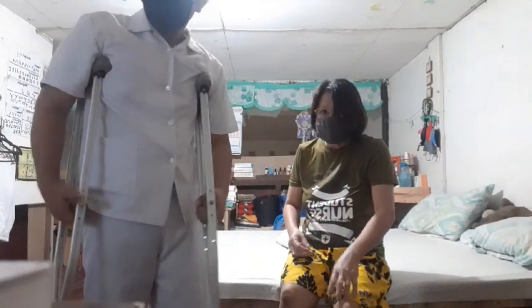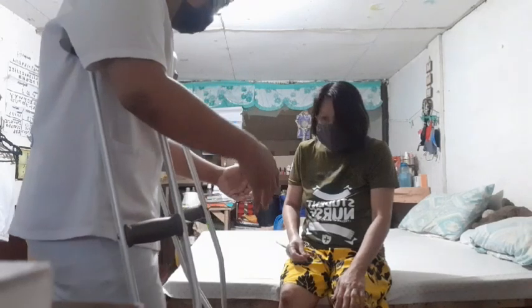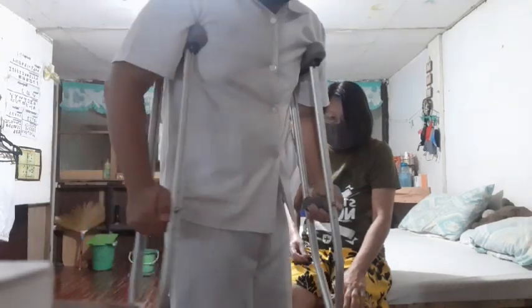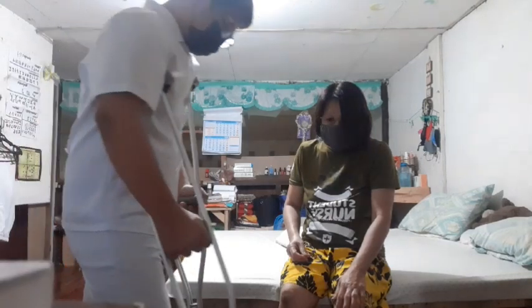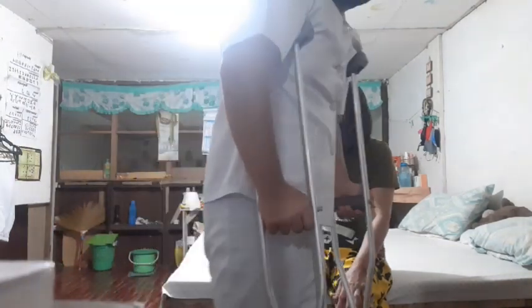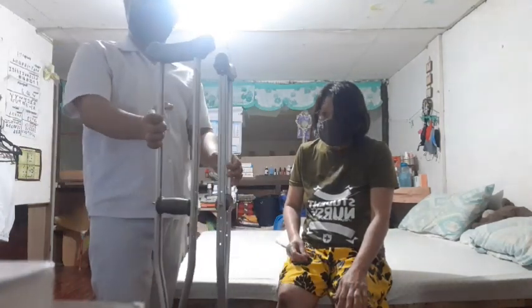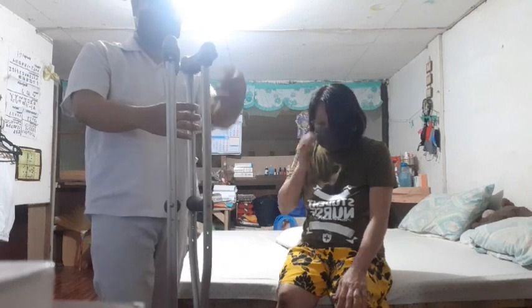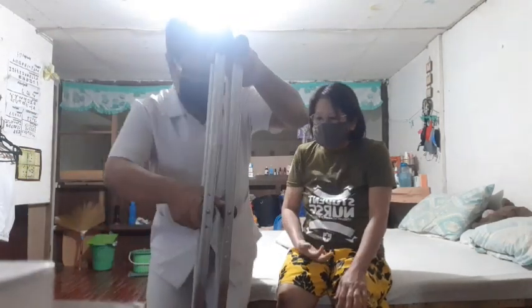Then you can also apply a safety belt. This is optional. Assist the client with maneuvers appropriate for the type of gait and with other general crutch walking techniques. Demonstrate the correct technique for the type of gait to be used before the client gets out of the bed. Then you can begin demonstrating the gait technique from a tripod position with the crutches 6 inches to the side and 6 inches to the front.